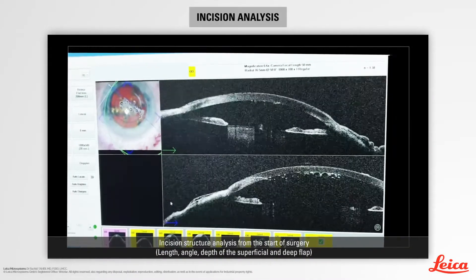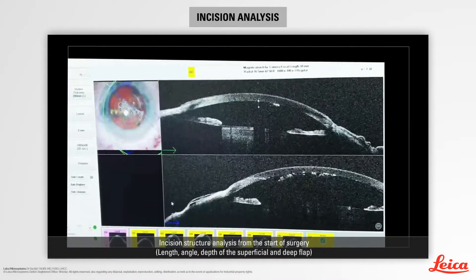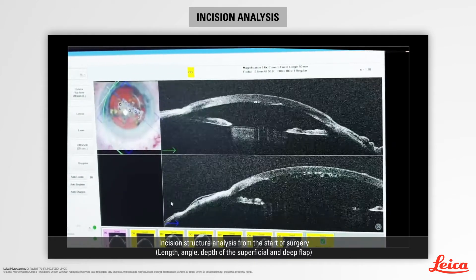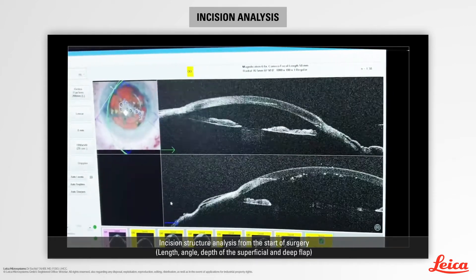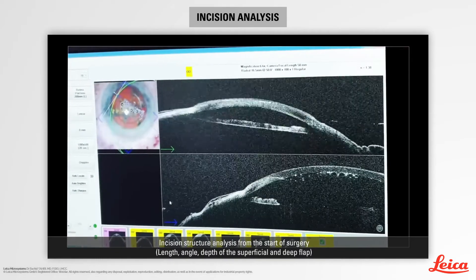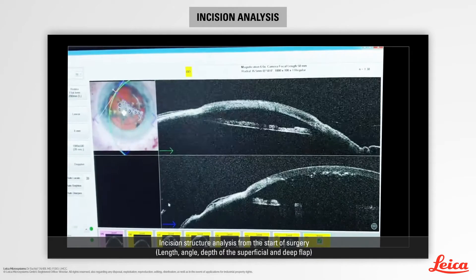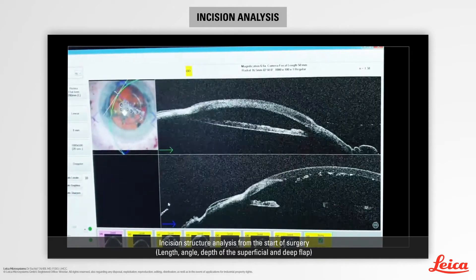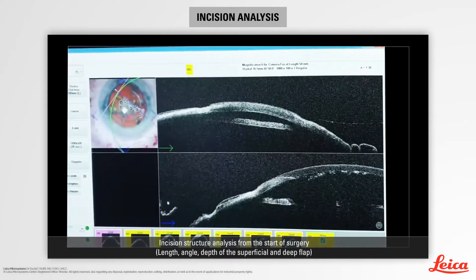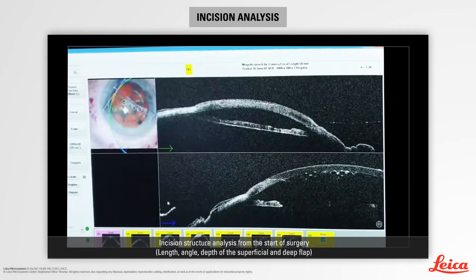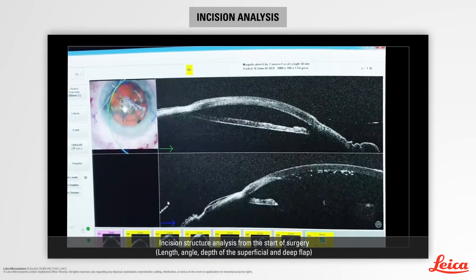In these examples, intraoperative OCT can give accurate and precise information about the incision architecture from the start of the surgery. We can clearly determine the incision length and the thickness of both superficial and deep flap. We can perform analysis both in the longitudinal and transversal sections.